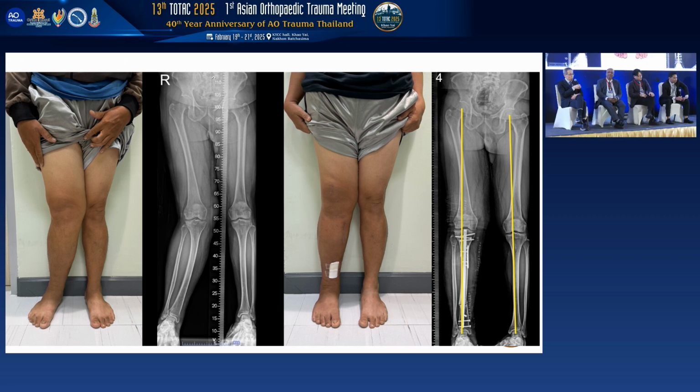Yeah, you can do that, but you will have a complication because you already had the osteotomy and some invasive procedure. I hate that small plate. You don't have to. You just make some chisel cuts, and then you can have a closing wedge osteotomy that way. I do not recommend the small plate. I've seen the small plate on the subtrochanter, the small plate on the proximal tibia. I don't want to see that.